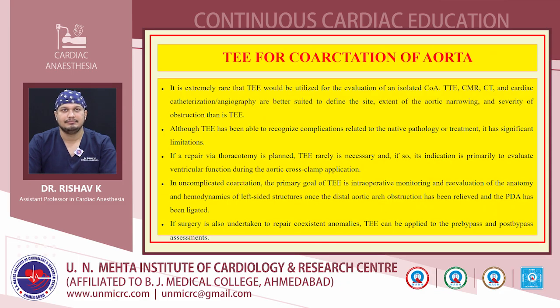It is extremely rare that TE would be utilized for the evaluation of isolated coarctation of the aorta because of the limitations associated with imaging of the arch and the arch vessels by TE. Transthoracic echocardiography, cardiac MRI, CT and cardiac catheterization angiography are better suited to define the site and to plan the surgical procedure. Although TE has been able to recognize complications, it has significant limitations, as I have already told. If a repair via thoracotomy is planned, then TE rarely is necessary, and if indicated, it is primarily to evaluate the ventricular function during the aortic cross-clamp application.